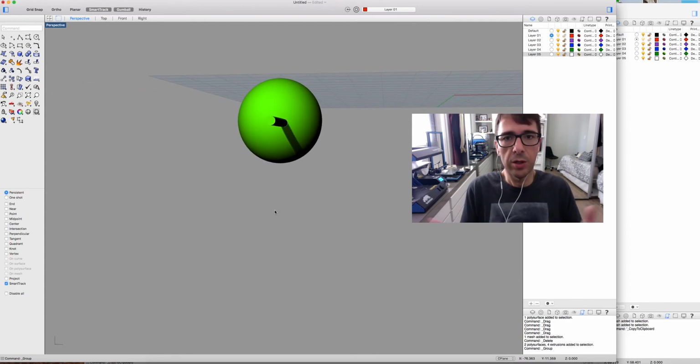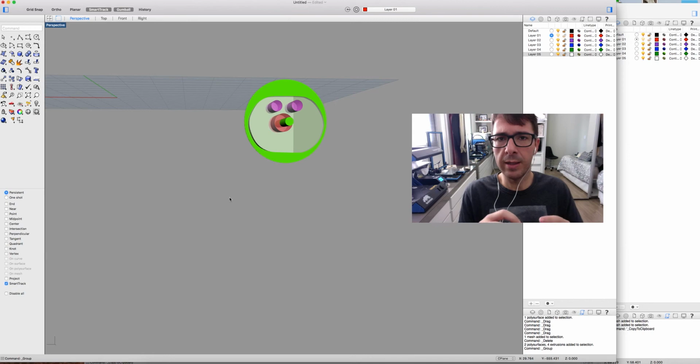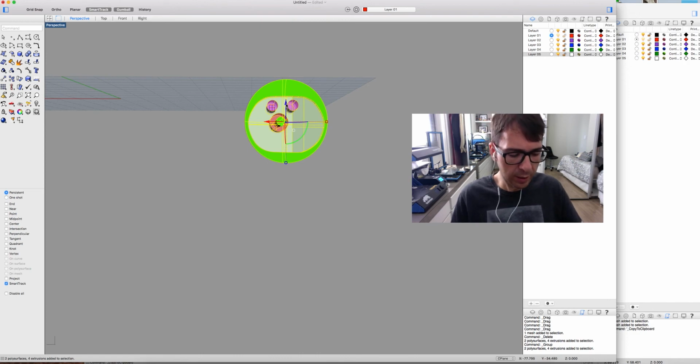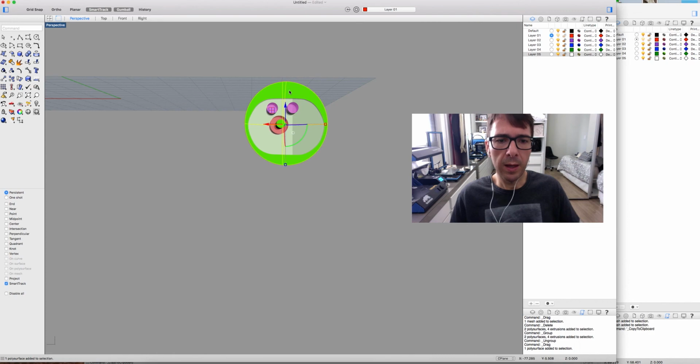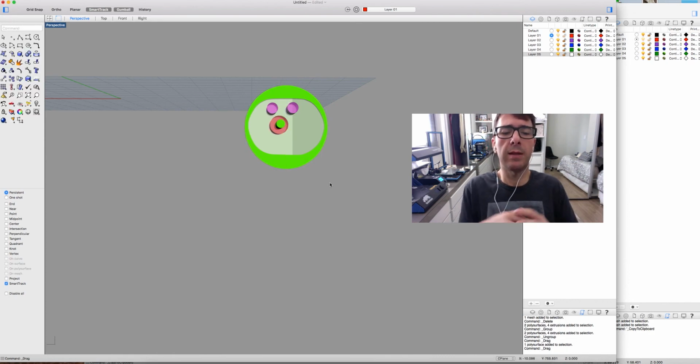So this is a very simple way. You can see that in some minutes we can design it. Of course, we could check if the diameter is correct, if the position is correct. I think we should move a little bit here, but this is just for tweaking and making it right for planning.